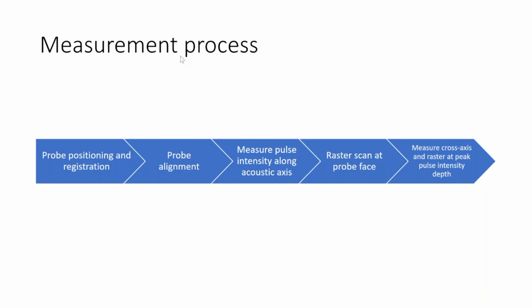That is an excellent question. In actuality, specifically the FDA does require the manufacturers to monitor their manufactured devices over time. Now that's different from, say, clinical life applications.